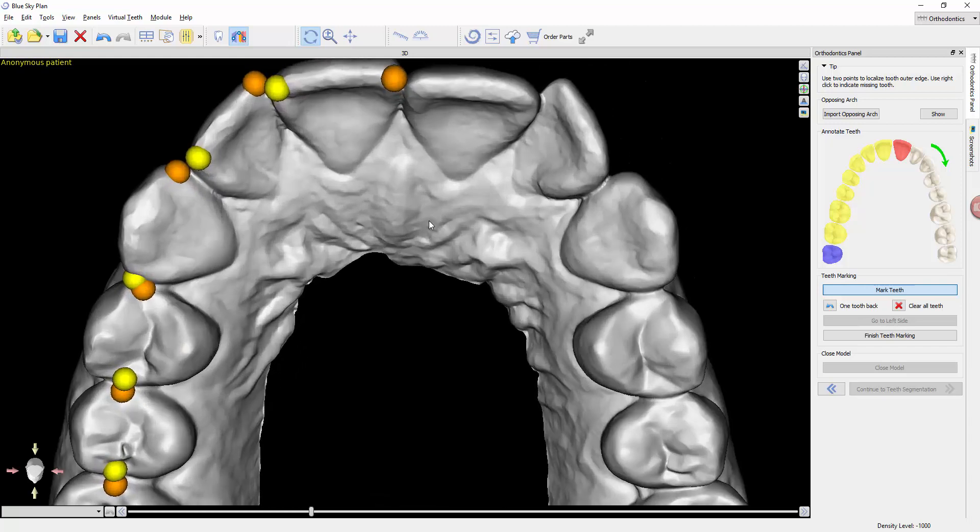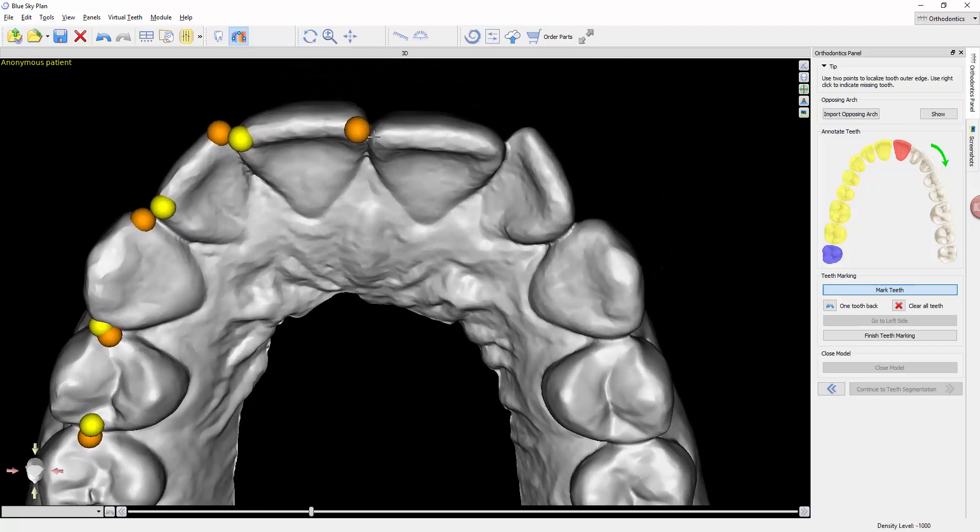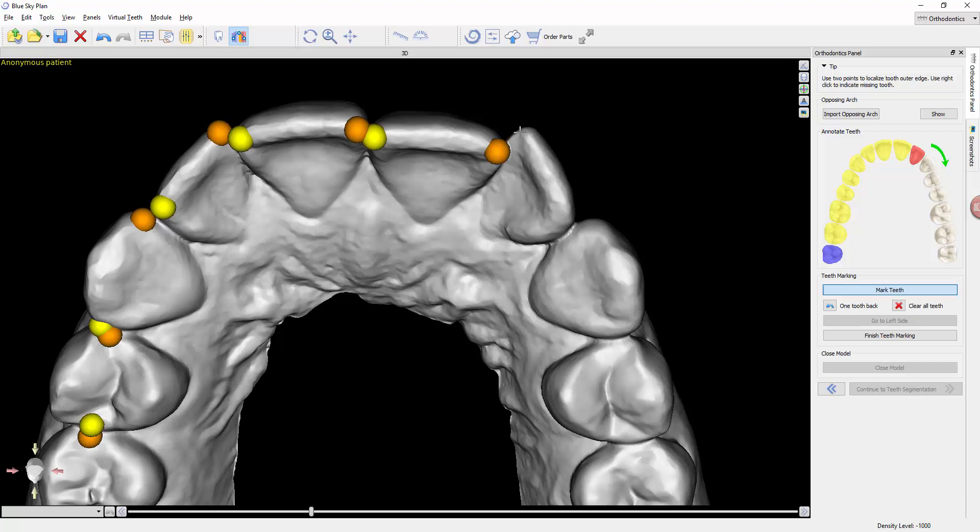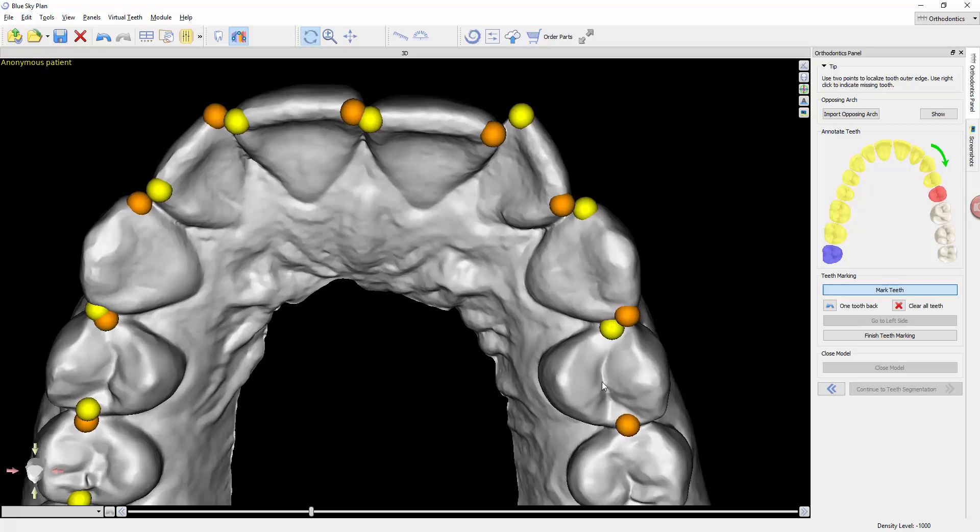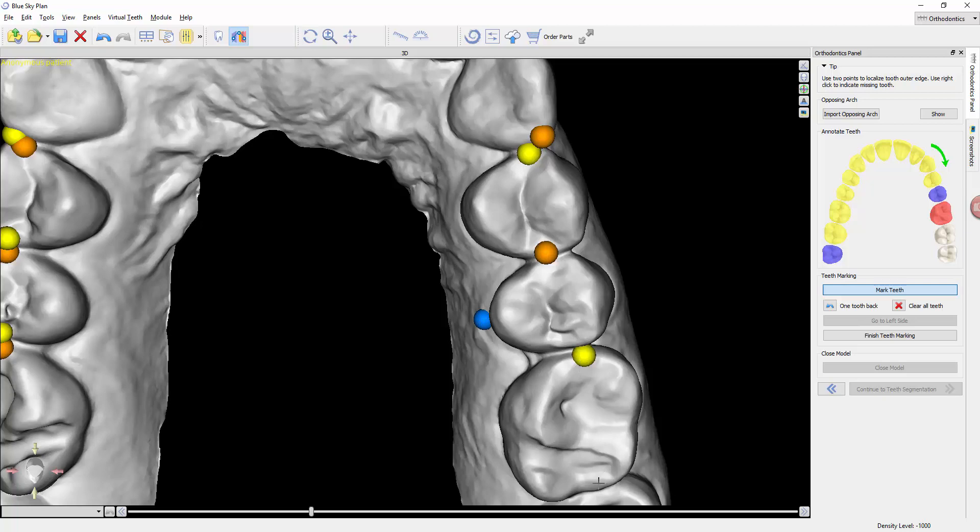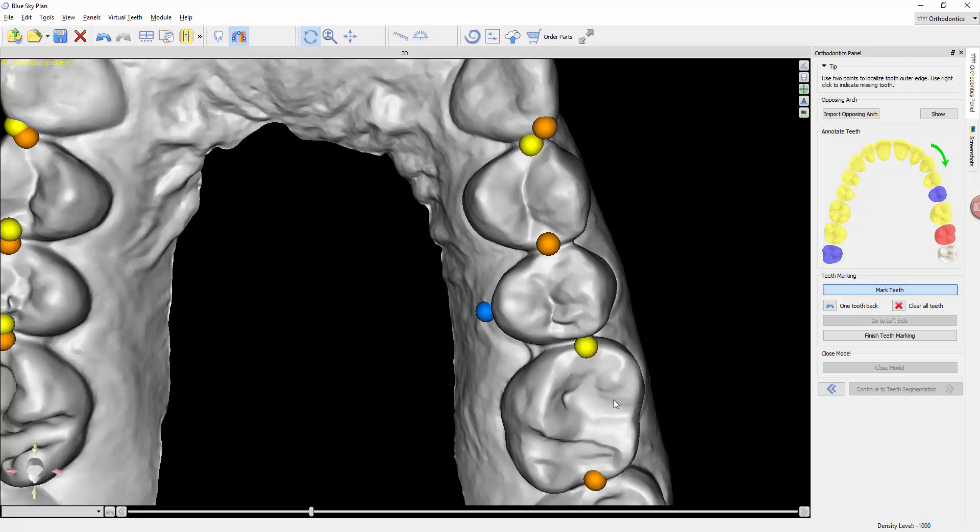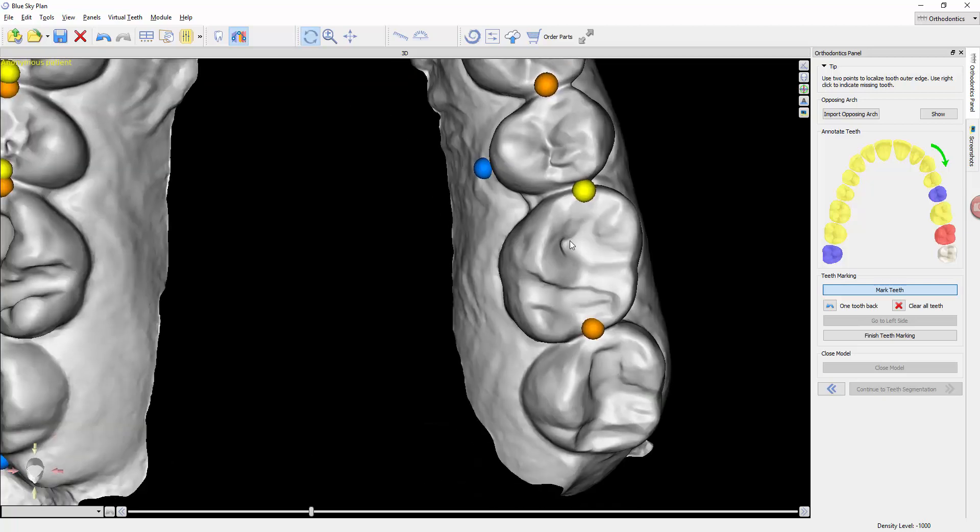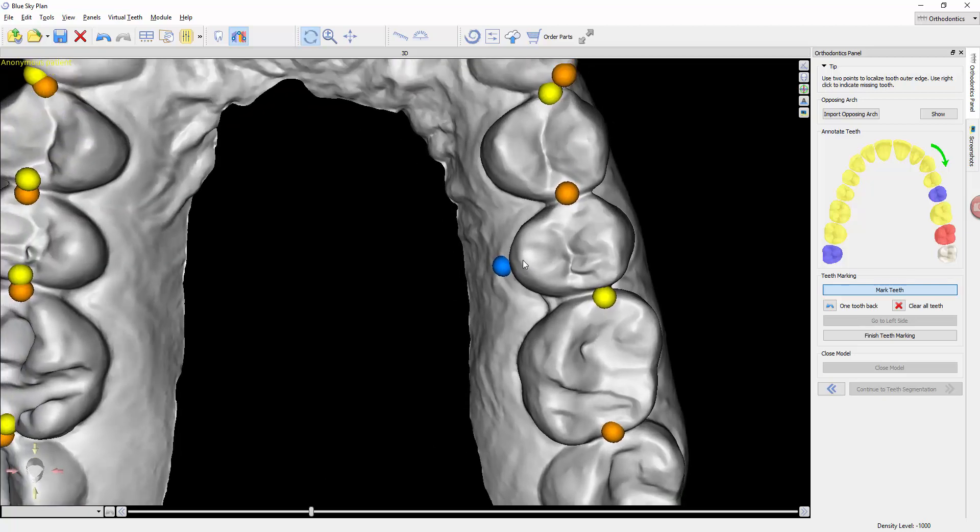If, for instance, I come to here and let's pretend the patient was missing their second premolar, I would mark this one, and if this tooth right here was gone, I would just right click the gingiva and keep clicking along. That just tells the software to ignore this blue dot and allows it to advance to the next tooth.